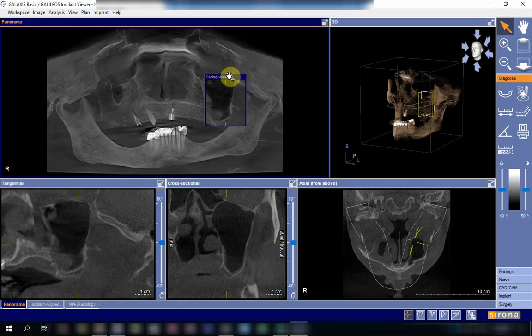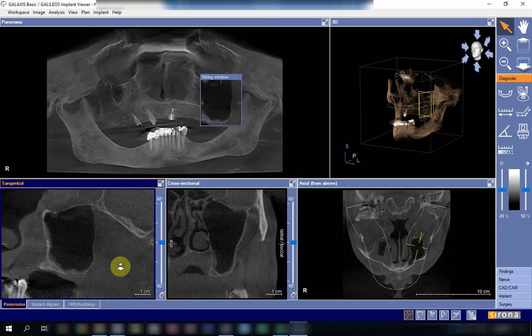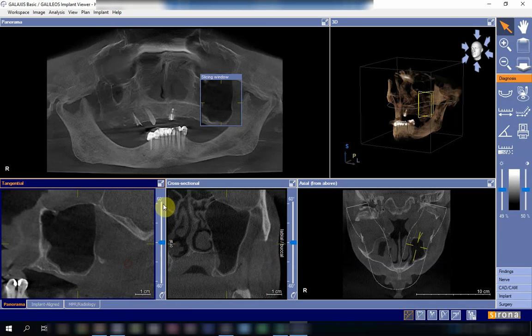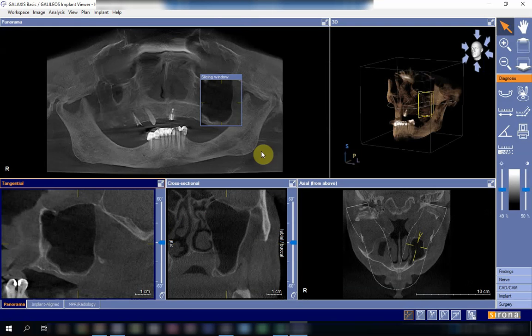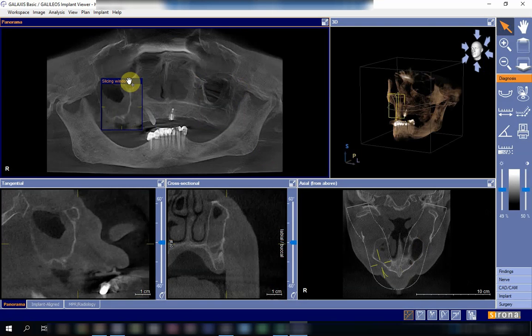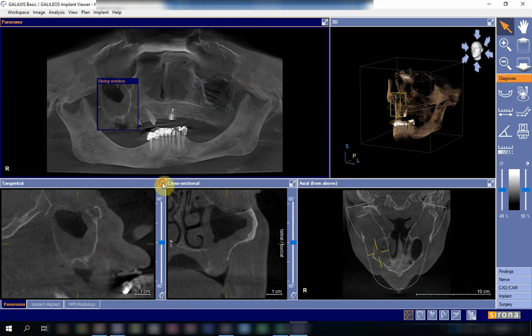Going to the left side, you can see very mild thickening of the floor of the maxillary sinus. If you compare it to the affected right side, you can clearly see the difference in the thickness of the inflamed tissue.